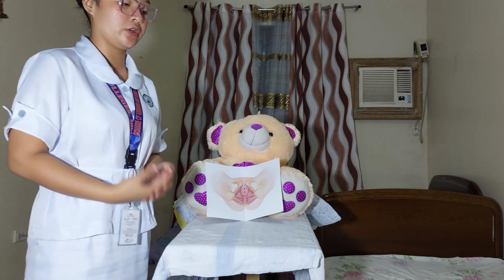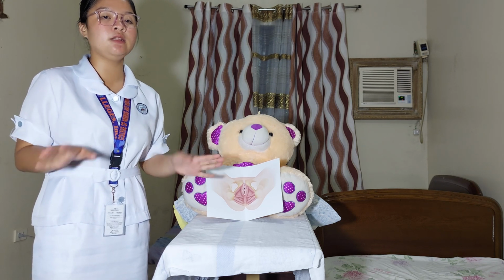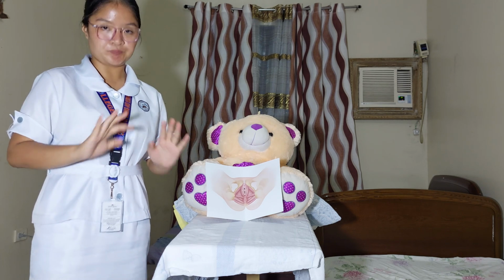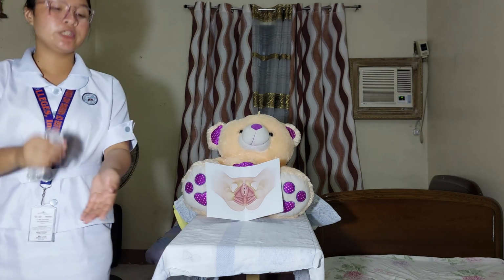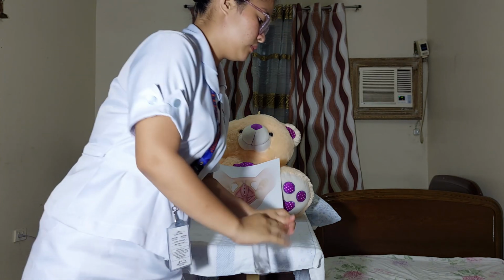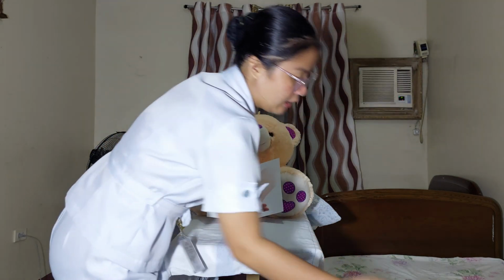urinary catheter. So, to do that, I'm going to practice a proper hand hygiene by washing my hands or by disinfecting my hands using the alcohol. So in my case, I already washed my hands, so now I'm just going to disinfect my hands using the alcohol. After disinfecting my hands, I'm going to wear a latex gloves.